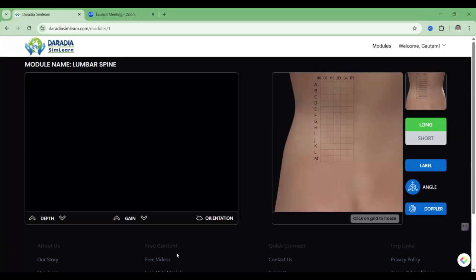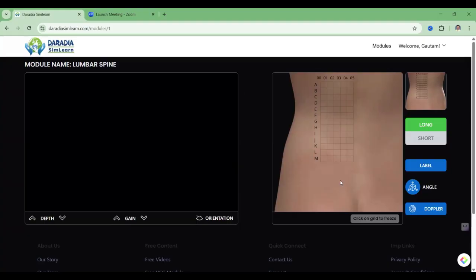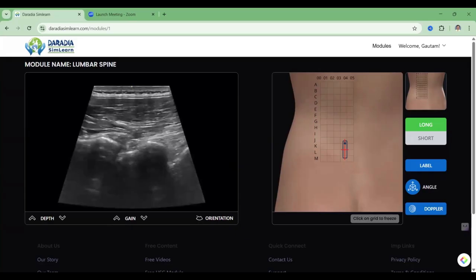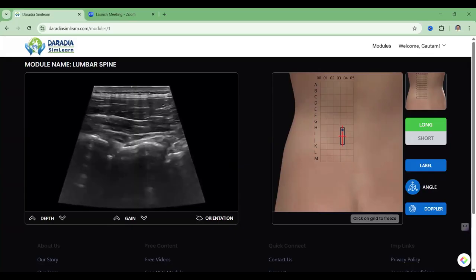Then you are going to get this image. Here you see on the corner there is a larger zoom-out image of the back, and then a zoomed-in image with some grids inside. On the left hand side, we are having a monitor just mimicking the ultrasonography monitor. Once I am taking this cursor inside this grid, it is going to convert into a probe. And now this probe is in the long axis.